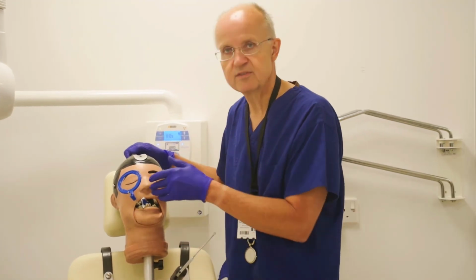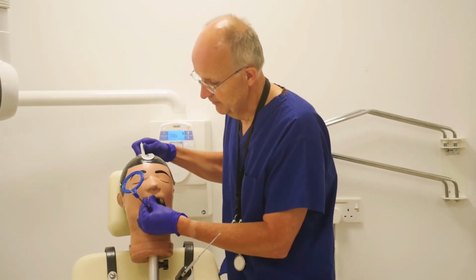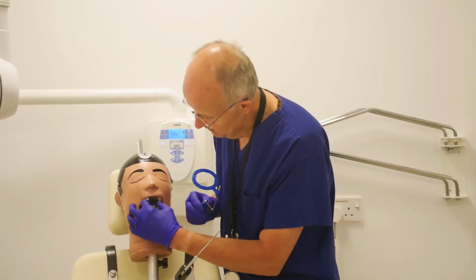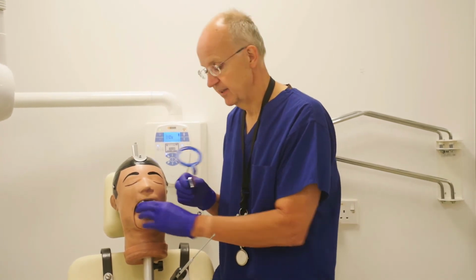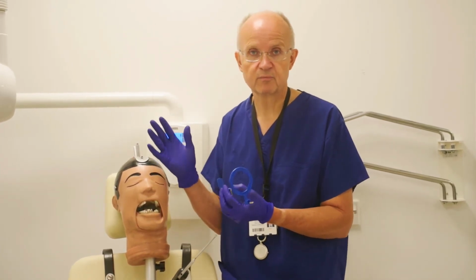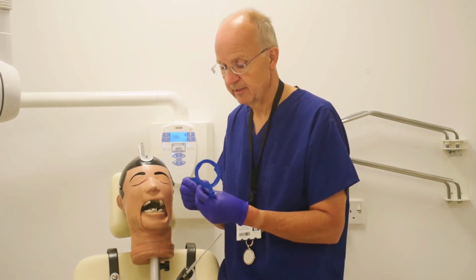Now, I don't know whether you can see what's happening there, but as the patient bites down, this whole holder is tilting away to the right. That's because he's got some broken teeth here on the bottom, and when he bites down there, it's not biting straight. That's not just a problem we have with Dexter, we have problems with all sorts of patients who've got different pathology in the mouth.